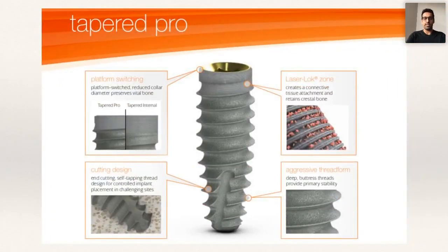So here's the Tapered Pro, which is the implant that in the previous slide was in the middle. And it's an aggressive pitch, self-tapping, and it's platform switched.